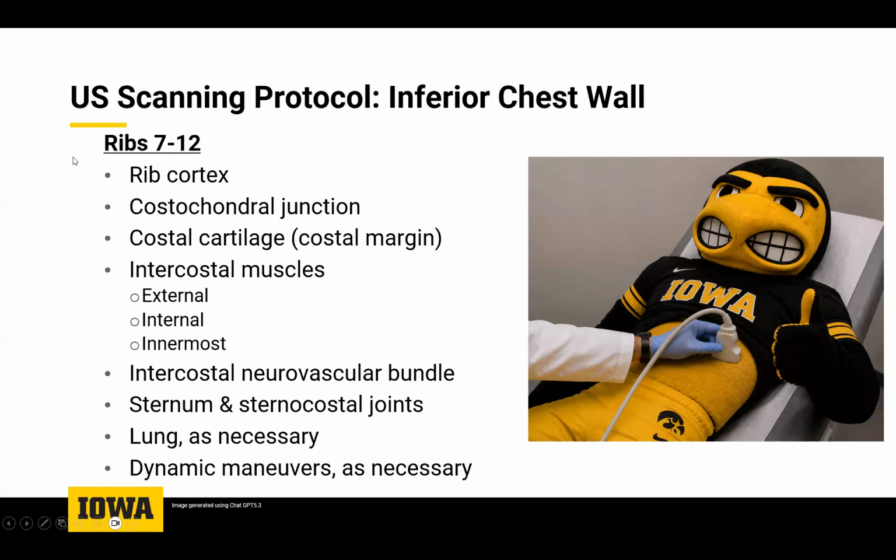My experience has been that the majority of referrals that I've received are for non-traumatic rib pain, whether it's pain from coughing, MVA, where it's sort of indirect, where there hasn't been a direct trauma to the chest wall. And I have found that it's really the minority of cases that we see an abnormality, whereas direct trauma to the ribs is a different story, as your cases present. And when I do see non-traumatic rib pain, we really liberally use contralateral comparisons. But the one area that I've seen in the chest wall where non-traumatic rib pain has been helpful is pain at the xiphoid process and then also the sternoclavicular joint.